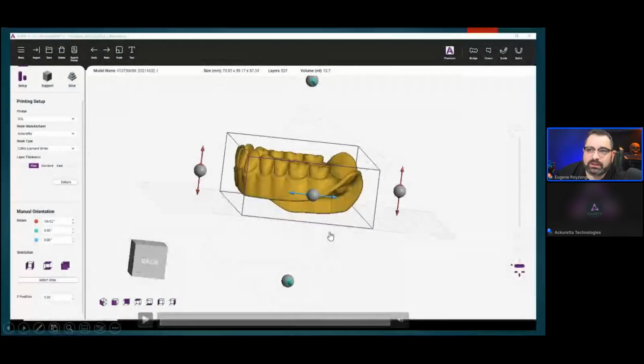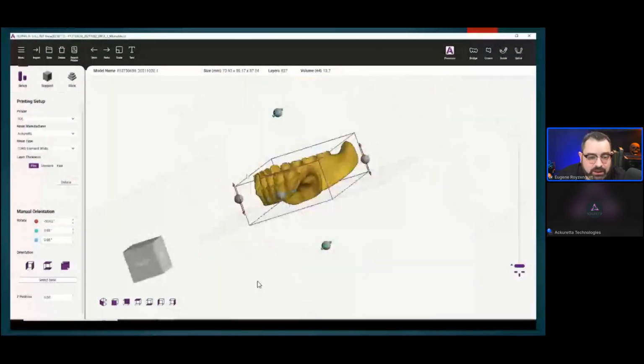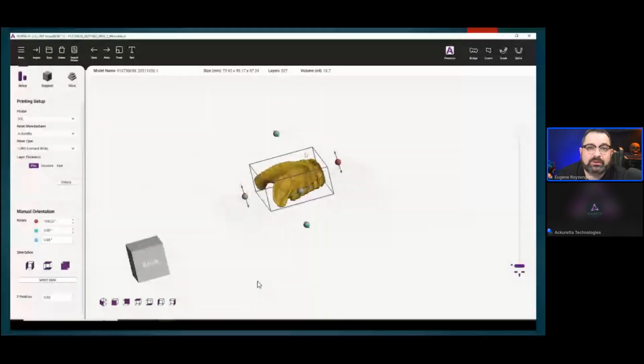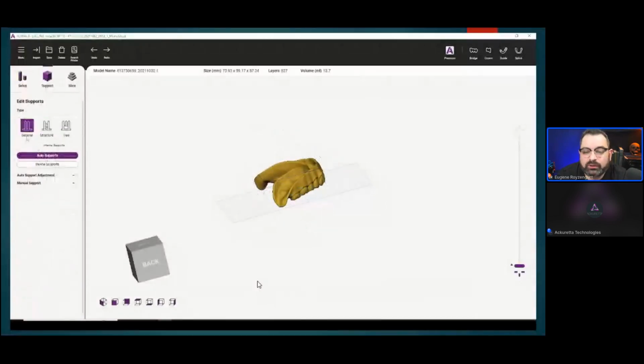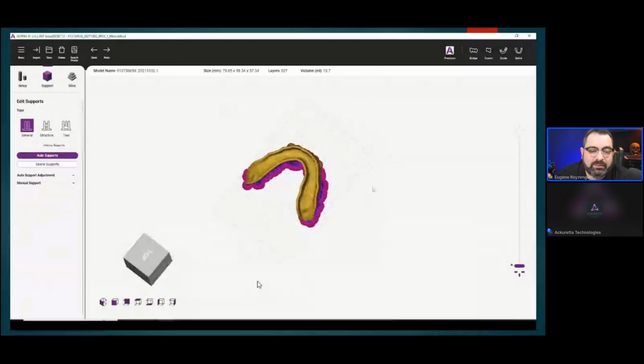This video right here talks about if you're doing a printed denture, for example, how to align it better. So there's a couple of things. When you print it flat like this, you will get the best possible occlusion, but the problem is you'll get a lot of supports on the intaglio surface. And if you're trying to print it as a definitive type of appliance where your patient's going to wear it and you're not going to reline it, well, it's going to be a problem.